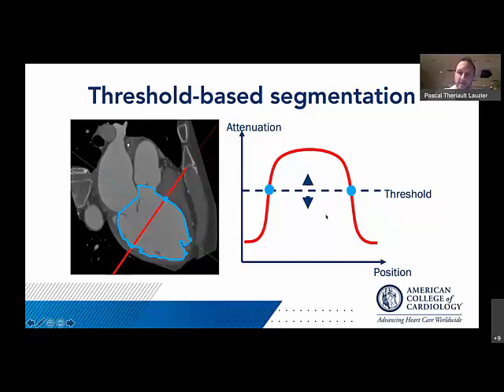So that is definitely something to be very careful with. And if you move too high with your threshold, then you will undersize your region of interest. So this is definitely a very crucial point, especially if you're trying to use a technique like this to plan a procedure. And in such a case, you would want very accurate measurements. So this needs to be done, of course, by an expert in order to get very accurate measurements.